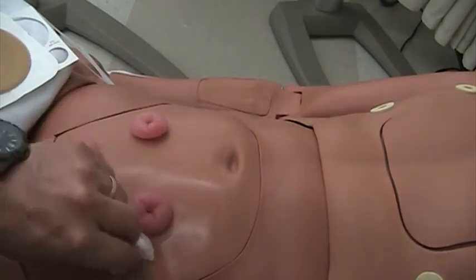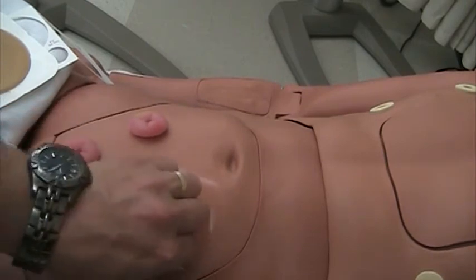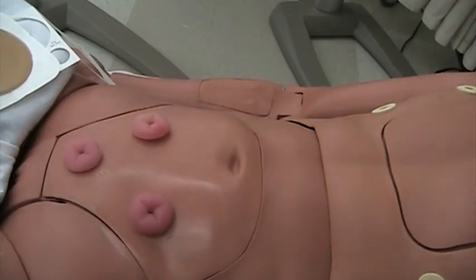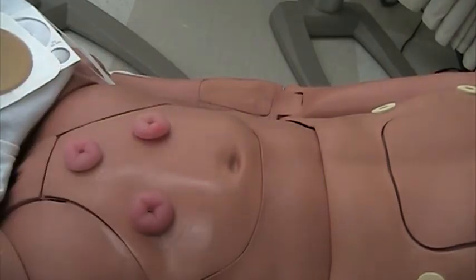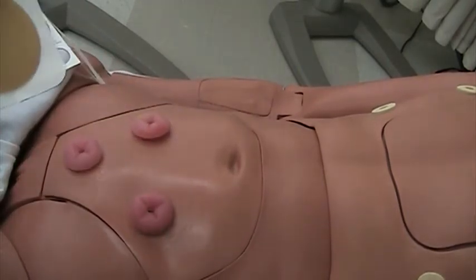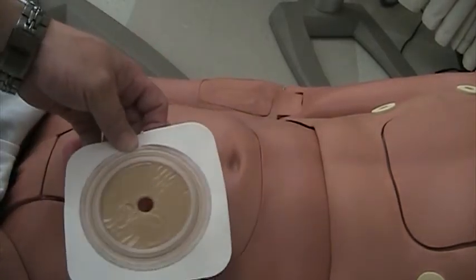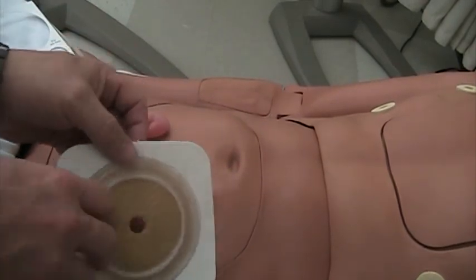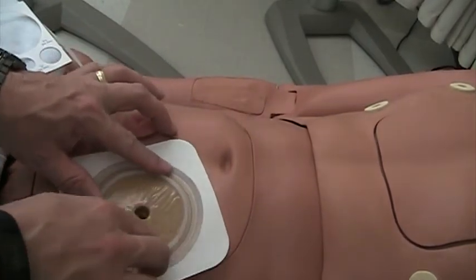You can kind of see a film around there, that's where it's wet. And when it dries, it leaves a small barrier that the wafer is still attached to, but it protects the skin. Okay, so I've got my correct stoma size, and I've got the wafer in place where the stoma is coming through it. Well, if you notice, there is, take that back out, there is a ring up here.